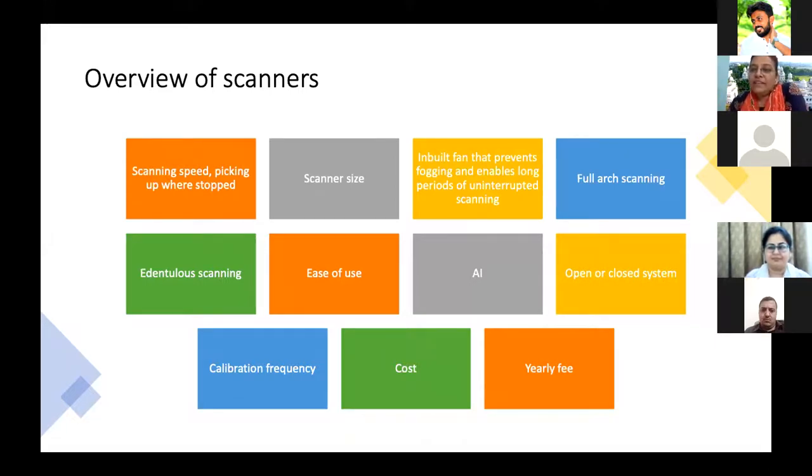We started scanning the ear because that was our focus of attention. Even with an intraoral scanner, we should not be fixed to scanning just the dental arch. We should be able to scan whatever we feel like. We scanned the ear and we were very happy. When we started using it, we thought, I have to give an inferior alveolar nerve block and I have to train my students. It's COVID time, we don't have access to patients, so we have to scan that area and train our students.